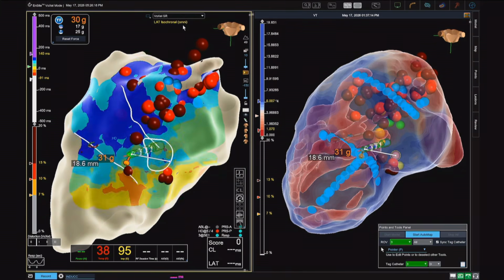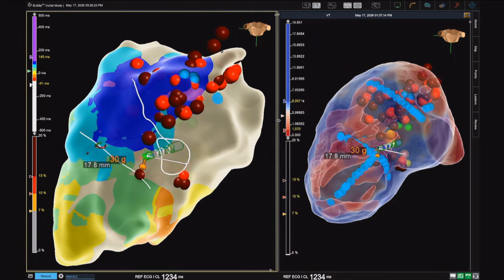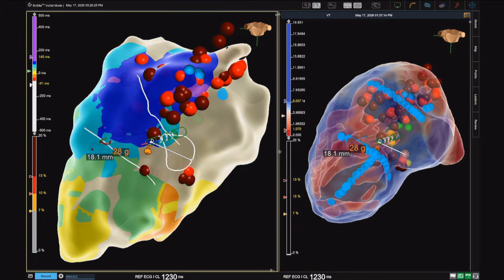Just what we mean by slow is these blue and violet colors, because the activation map is generated as late potentials or late activations. By ablating this, you generally decrease it and you see just the near field, far field kind of thing. Especially the first remap, because the first one was very incomplete. So the first remap.